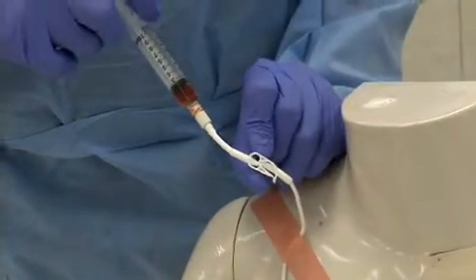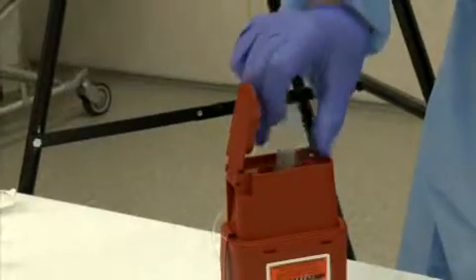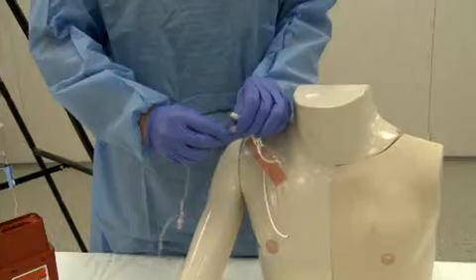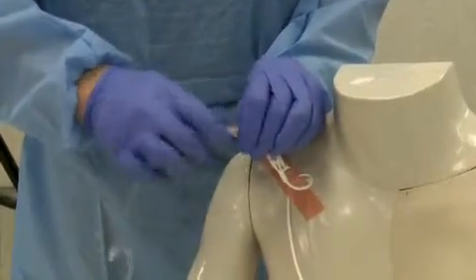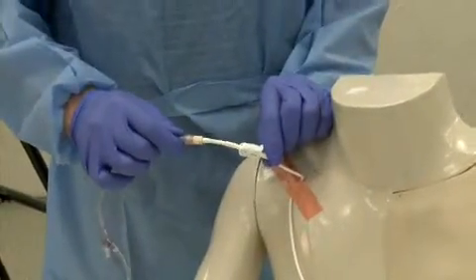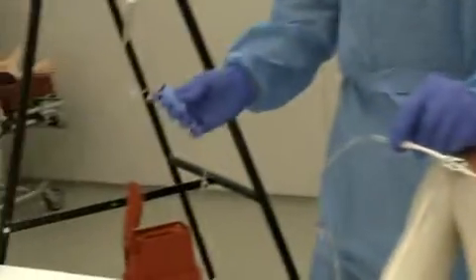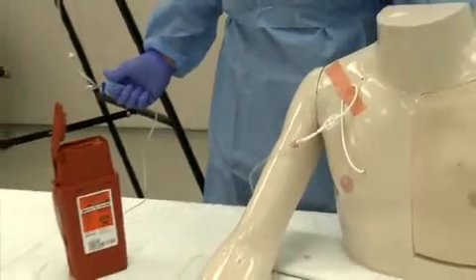Close the inline clamp, disengage the syringe, and dispose of it safely in a biohazard container. Note that through this entire procedure, the CVAD port is always in control of your non-dominant hand, so you can maintain visual contact with the port and minimize risk of contamination. Next, attach the IV tubing, engage the Luer lock, and open the inline clamp. Then open the IV tubing roller clamp and set the IV flow to the desired drip rate. Secure the line in place with tape.